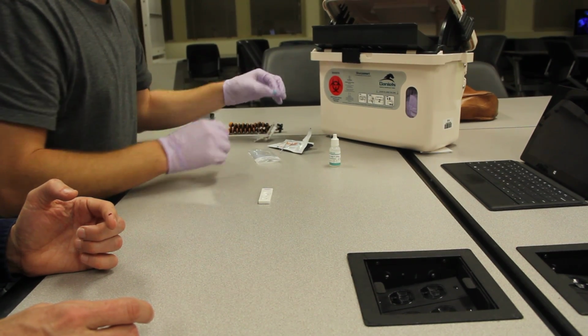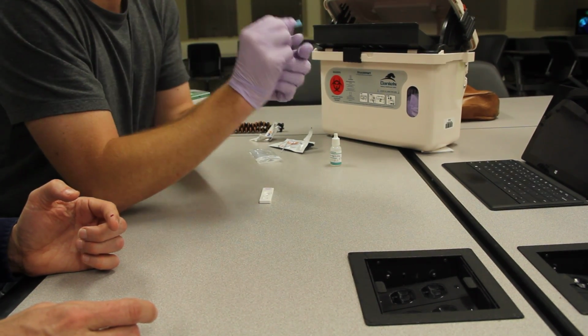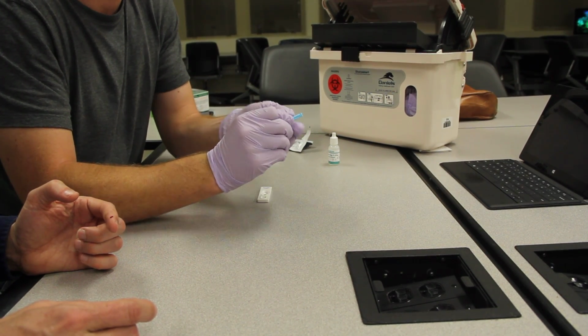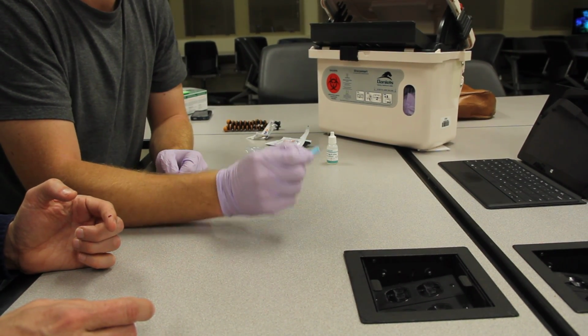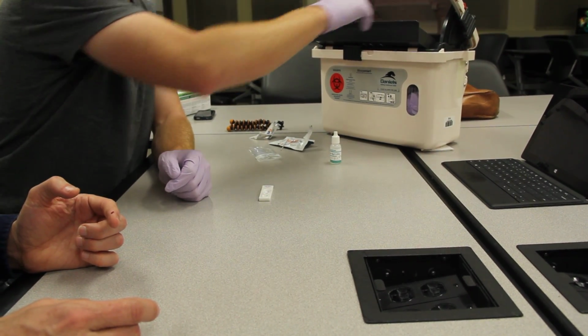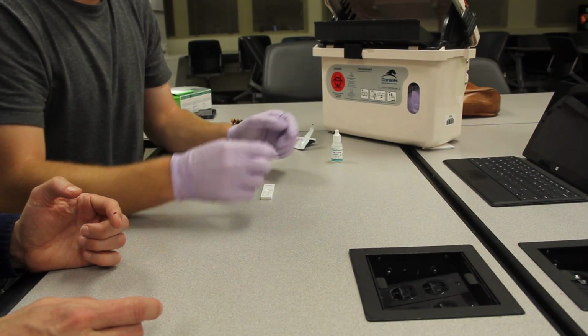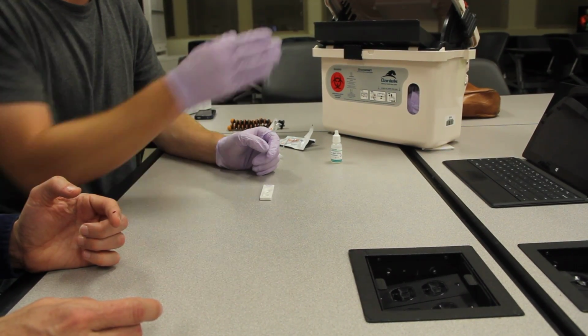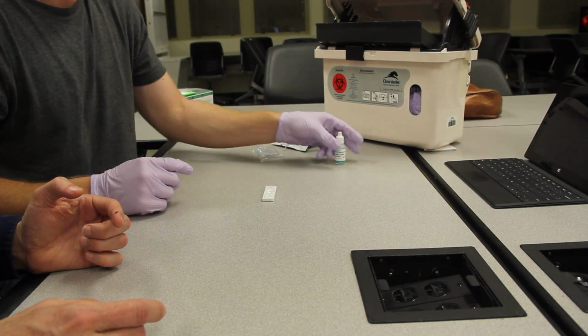Sharps. Yes. And one step that I forgot, this is actually a very common mistake and one that you really need to make sure you don't make, is immediately after you prick the patient's finger, you dispose of your lancet in a sharps bin. Otherwise, you can find yourself accidentally pricking someone else and transferring whatever infection might be in their blood to another person. So don't do what I just did.